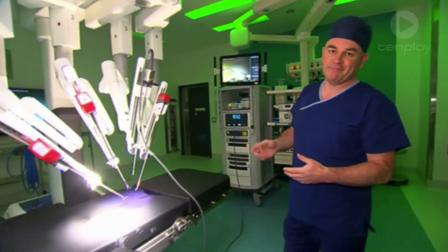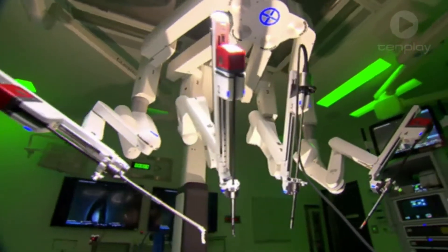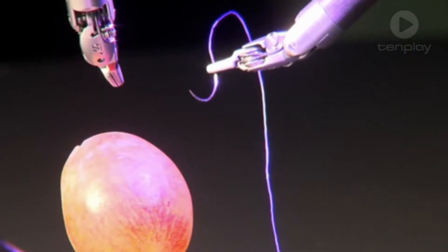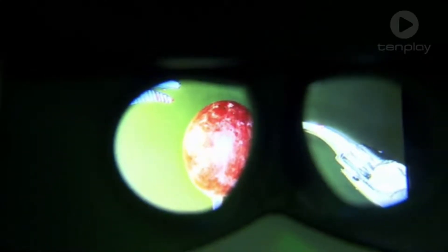Today I'm going to show you the incredible things our surgery robot can do. Let's check it out. Meet our DaVinci robot, Australia's most advanced surgery robot. This robot performs very complex surgery inside the human body with a tiny set of robot hands that are controlled by the surgeon via a remote console.